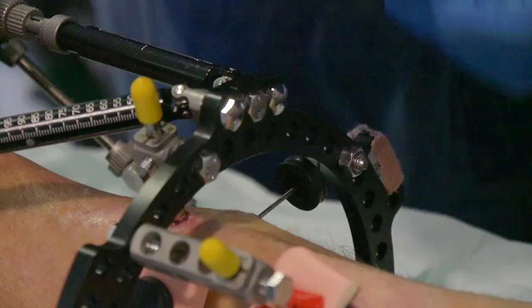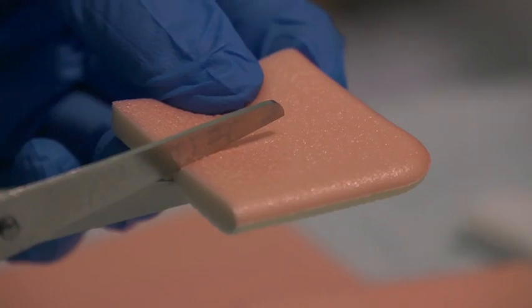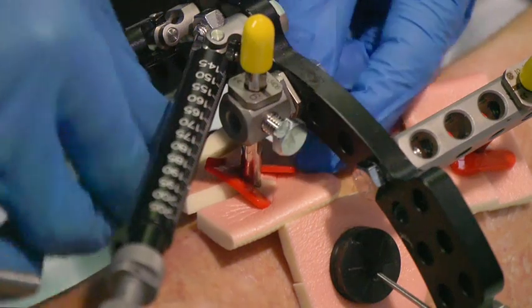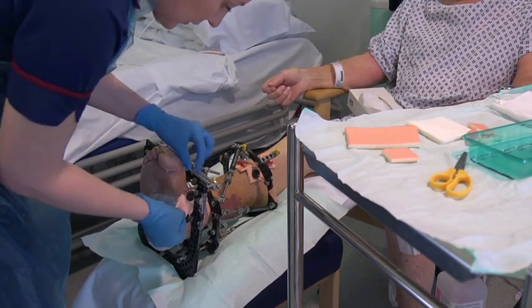Cut a slit into a square of the sponge dressing to fit around each pin sight. Wires close together may need one dressing with two slits. Gently push the bung or clip down to secure the dressing in place, but make sure they don't dig into the skin or they could cause sores.